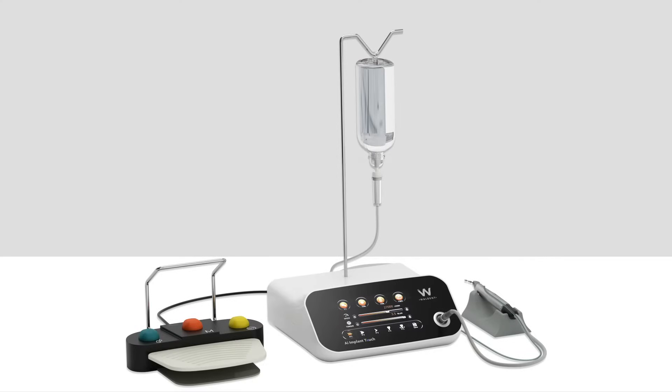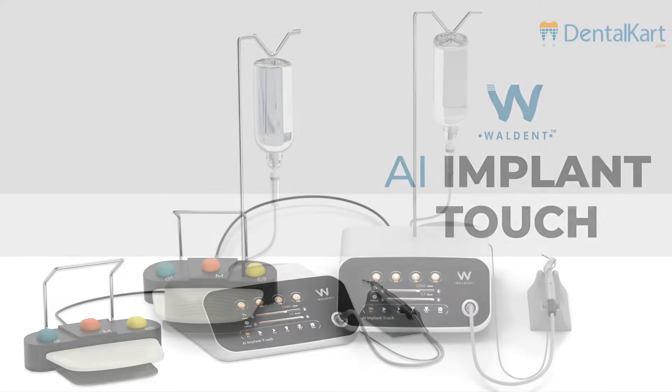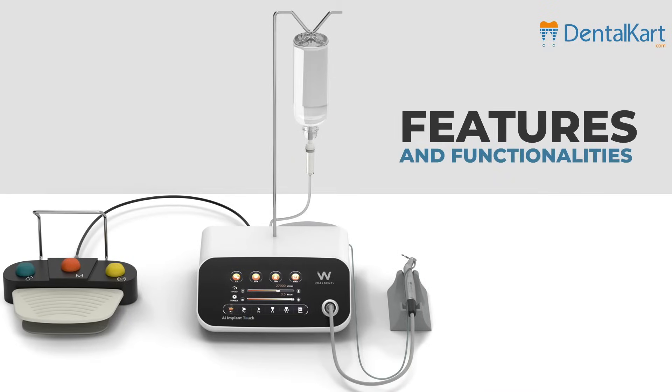Welcome, viewers, to an exciting demonstration of the Walden AI Implant Touch Implant Motor. Today, we'll walk you through its innovative features and functionalities.